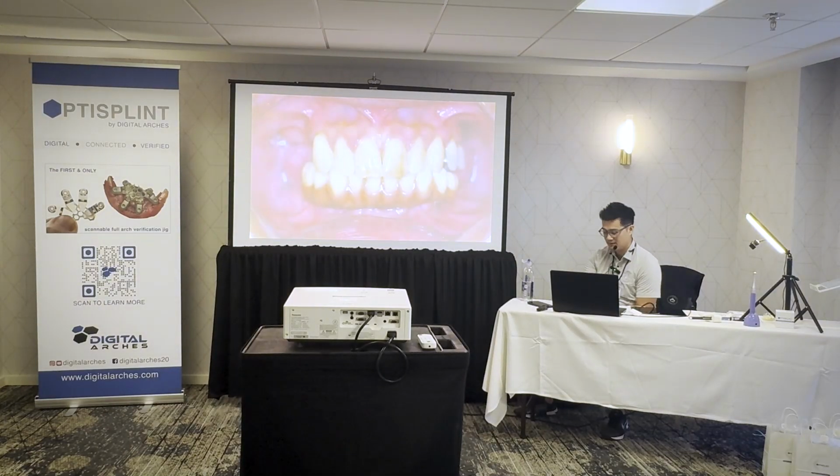So for Pamela, she had surgery, the next day we delivered the temp, and then her third appointment was to deliver the final. That was it. This is on time basis. Question: quite often on the surgeries, the surgeon will choose not to torque to 35 to prevent spinning implants. How do you account for that with that two-step process?